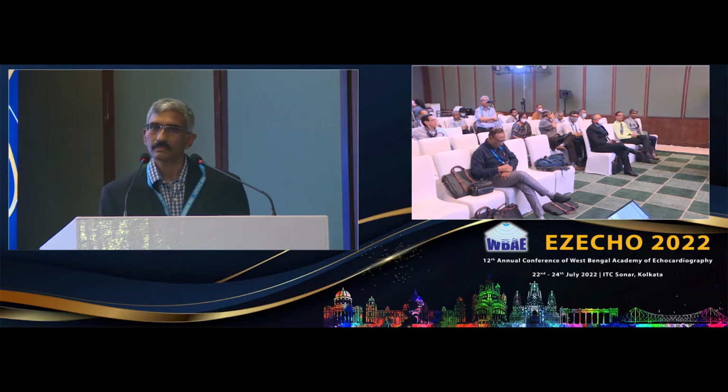Is 3 Tesla necessarily better than 1.5 for MRI scan? No, I don't think it's necessary. Most of us have either one or the other. We have either the 1.5 or the 3 Tesla. Either one is going to be fine.